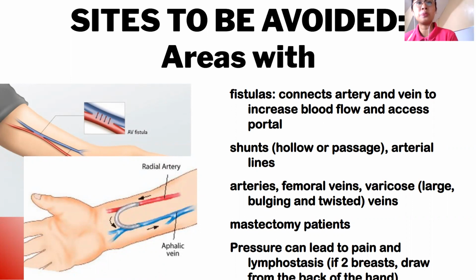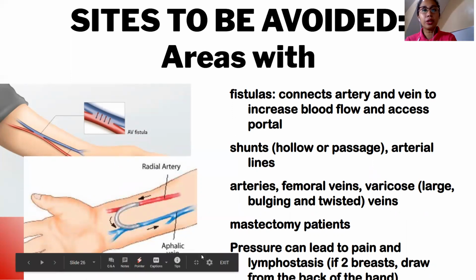Kayo tutusok dito. Sometimes when I was an intern, they called interns to go to the dialysis center and extract blood. I was happy that the nurses instructed me, "Ma'am, don't extract here because there is a fistula. Ma'am, don't extract here because there's a shunt." And you can ask the patient. Alam din naman nila.